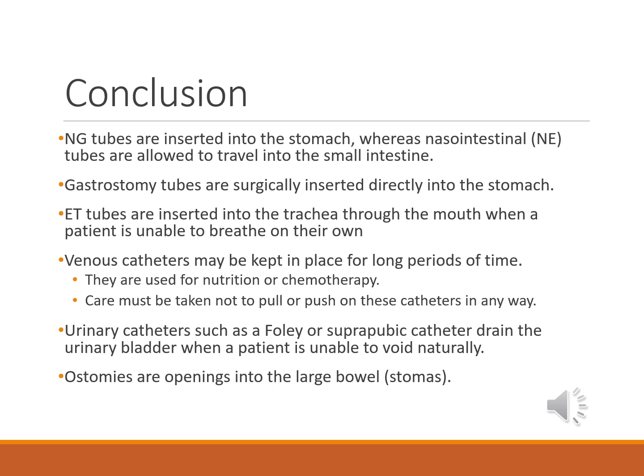Lastly, ostomies are openings within the large bowel. These are called stomas. Patients who have an ostomy have undergone an extensive bowel surgery. So the fecal matter is being outputted into a bag through the stoma. It's important to handle the bags with care and treat patients kindly. Patients with ostomies and stomas tend to be very self-conscious.